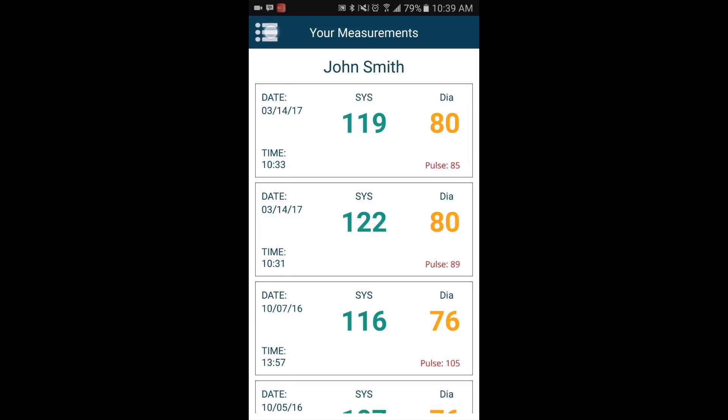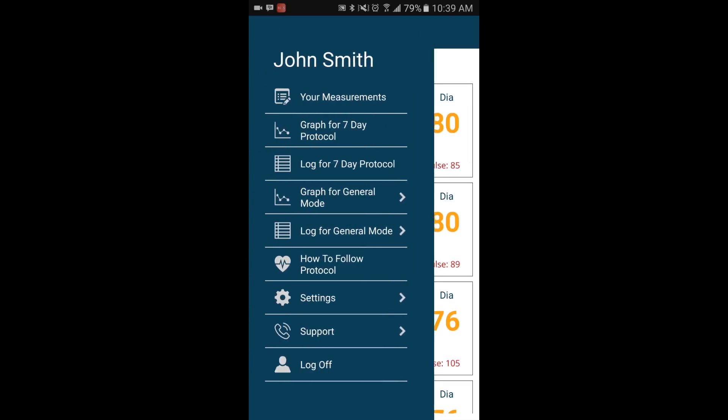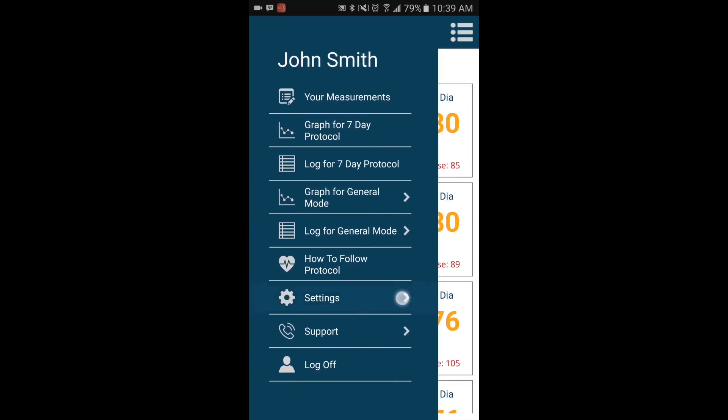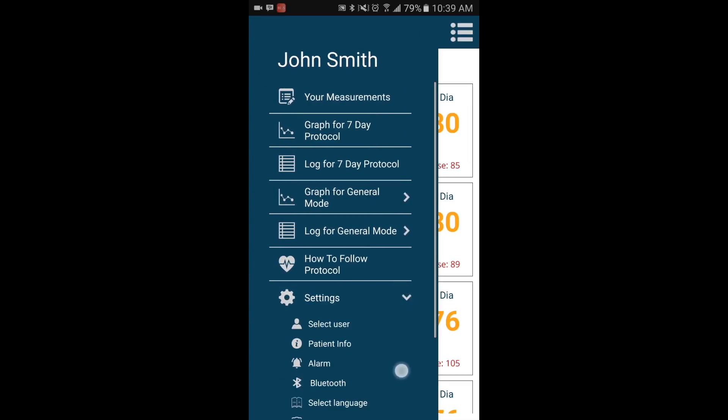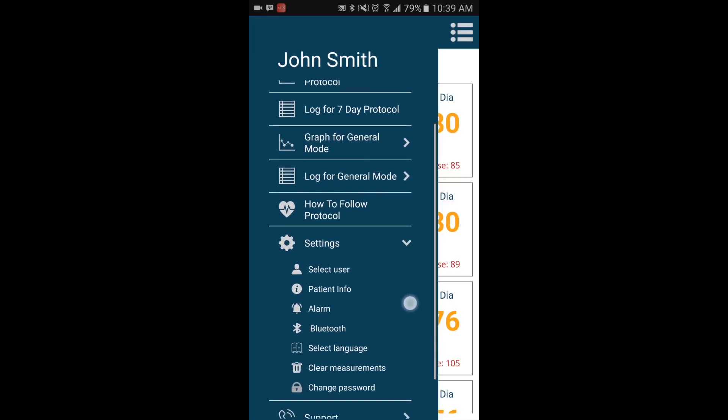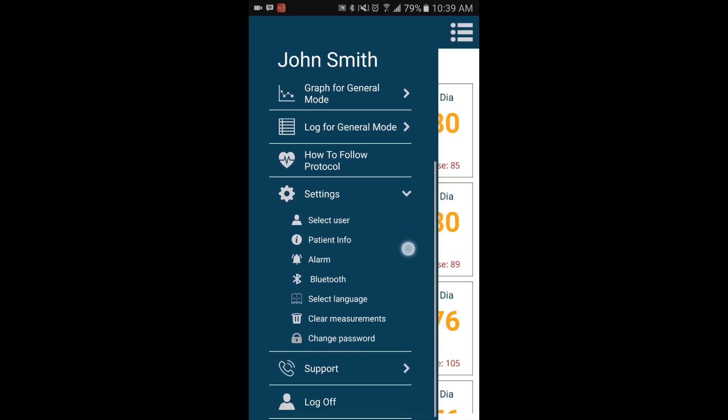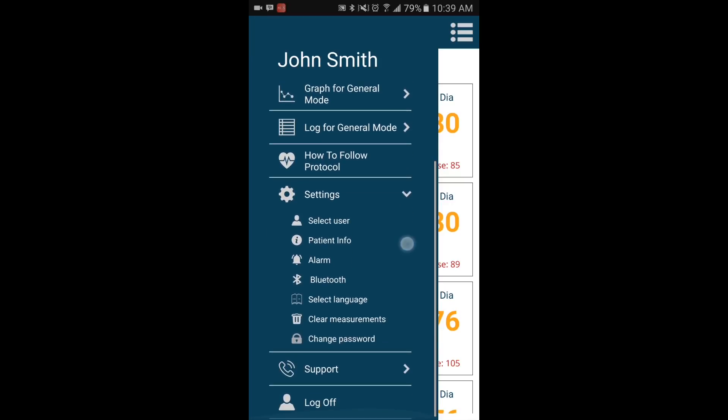The app features an alarm function to help remind you when it's time to take a measurement. To set the alarm from the home screen, go into Settings, then Alarm.